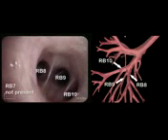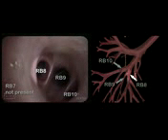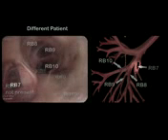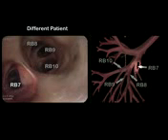When we extend further down the lower lobe, we reach the basal branches: the anterior basal branch, or RB8, the lateral basal branch, or RB9, and the posterior basal branch, or RB10. In most cases, the medial basal branch, or RB7, can be found at the medial side of the lower lobe bronchus. In this patient, however, the RB7 is absent. This picture from a different patient shows an example of the medial basal branch, or RB7, of the lower lobe.